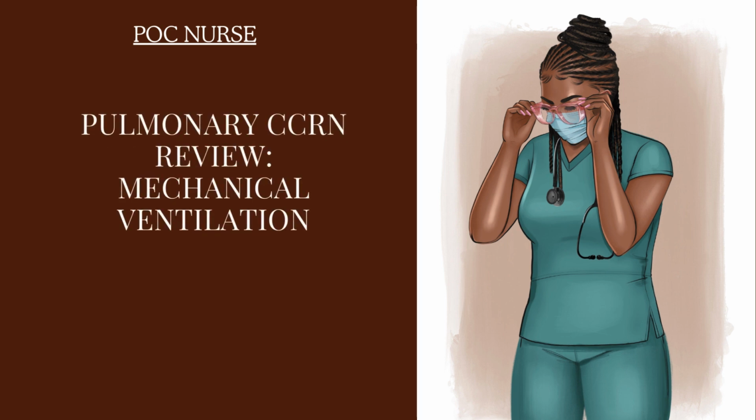My name is Gozi, and in this video we're going to talk about mechanical ventilation for the respiratory section of the CCRN exam. So mechanical ventilation is a form of oxygen delivery. It's usually used in critically ill patients to sustain life emergently or in acute situations.